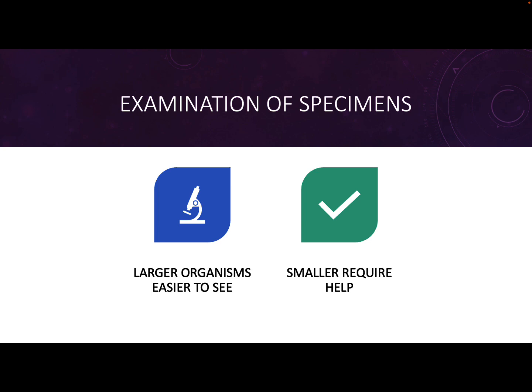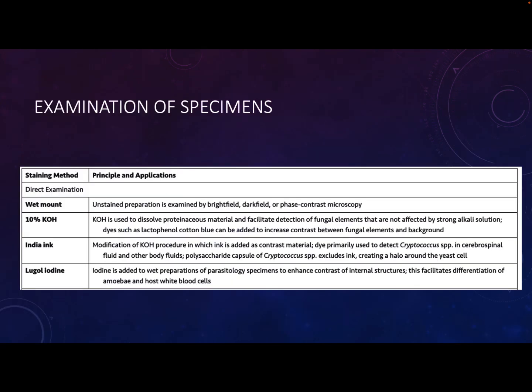So we left off on Monday talking about how clinicians or clinical lab scientists examine specimens, and we were talking about microscopy. For the most part, what we're talking about in this class is going to be very small: bacteria, viruses, and fungi, the majority of which that cause human disease are unicellular yeasts. We'll also talk about some protozoans and other parasites, again mostly unicellular. Unless we're talking about things like worms, it's really hard to actually see an agent that causes an infection. So that's why we use a microscope.